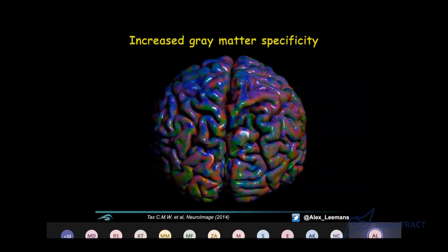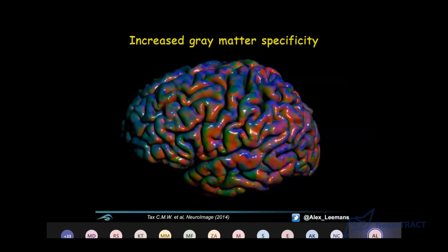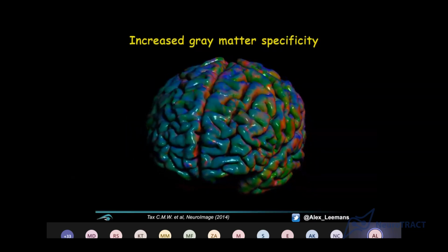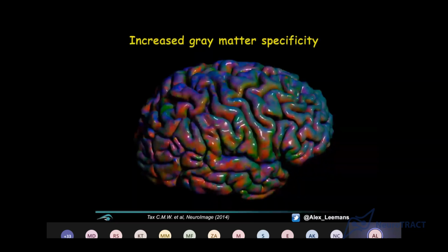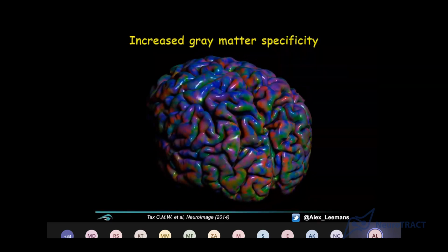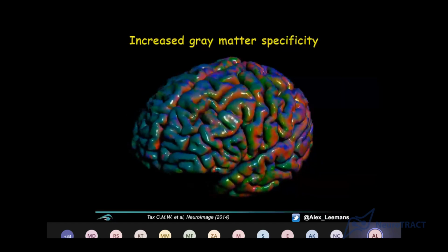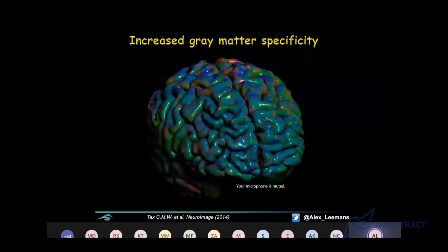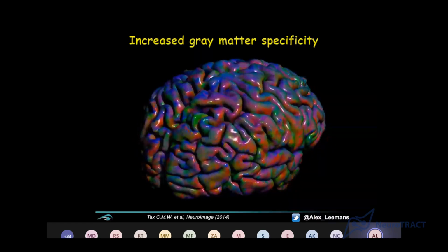And that's what I'm showing here. What I'm basically showing here is the cortical surface, the pial surface, and on top of that, I'm showing you the local organization of fiber tissue. Again, focusing on the dominant orientation. So that was kind of a cool try to see how does it look? And it's showing you, in a way, properties that you expect, right?